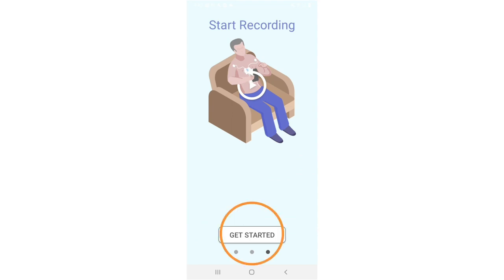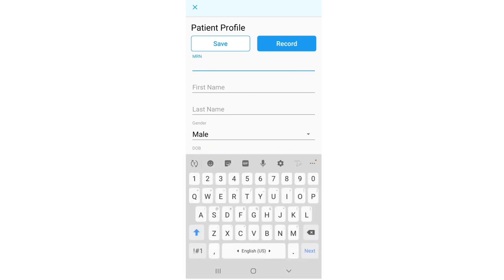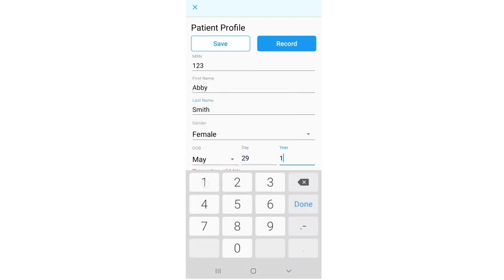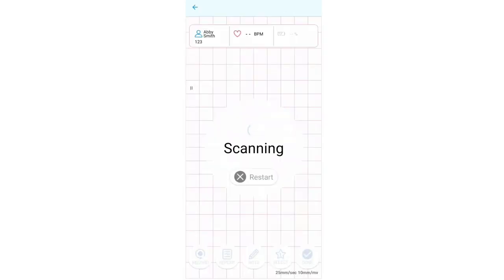Press to get started. Tap on the new button to input the patient's medical record number, MRN or any arbitrary numbers if unknown, first and last name, gender, date of birth, and electrode strip size. When you are finished, click on the record icon to start recording.